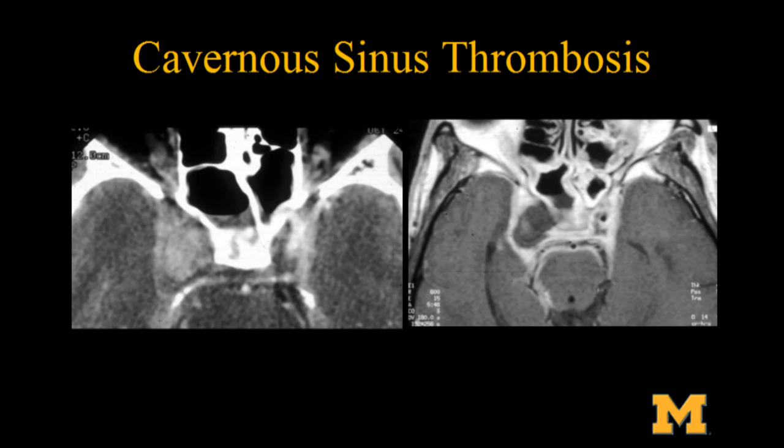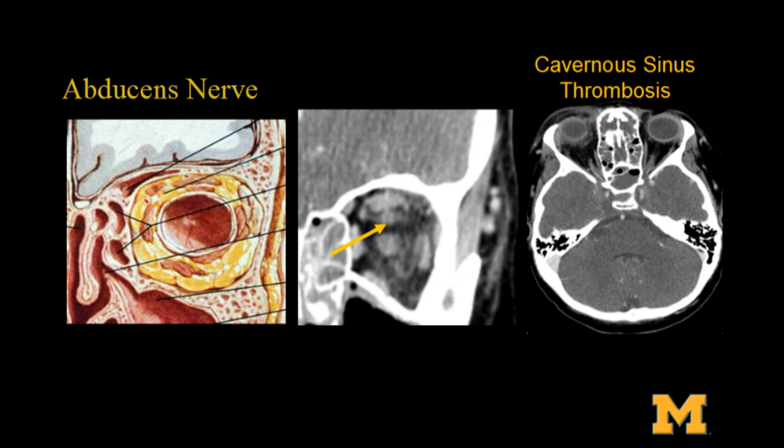Have you ever had the feeling of impending doom when you've dictated a study? Have you ever dictated a study and are about to click sign and then you just get this queasy, nauseous feeling like you're missing something? Or am I the only one that's ever happened to? So I was about to hit sign, and I said, something's just not right. So what is it here that tells you that this is more than just regular periorbital infection?